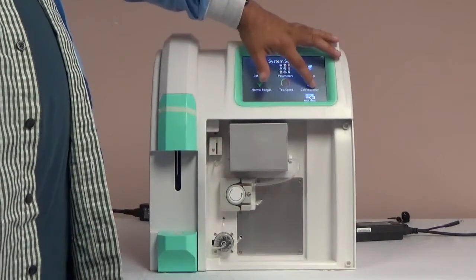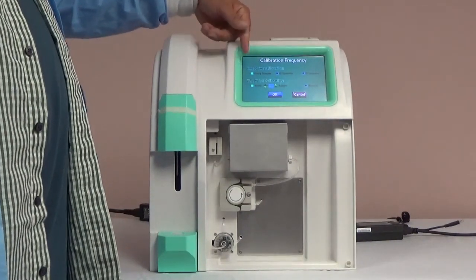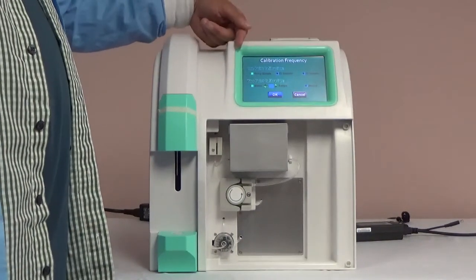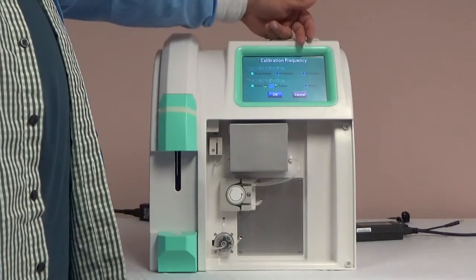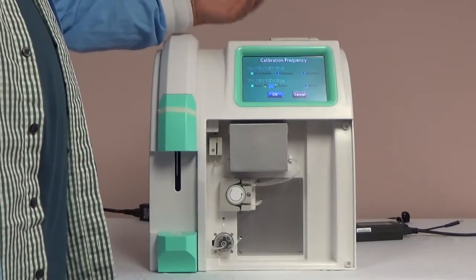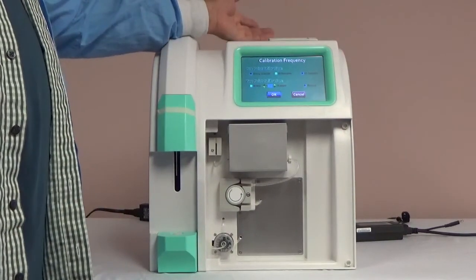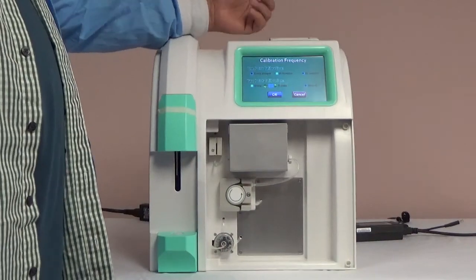On the calibration frequency screen, you can adjust the 1 point and 2 point calibration. These calibrations are performed during the sample testing. The recommended settings are every 10 samples for 1 point calibration and every 20 samples for 2 point calibration. If you adjust these settings, save your settings by selecting OK and return to the main menu.